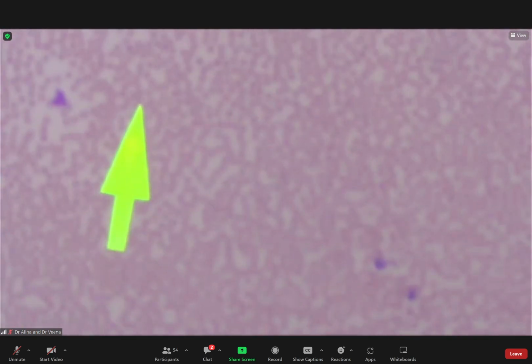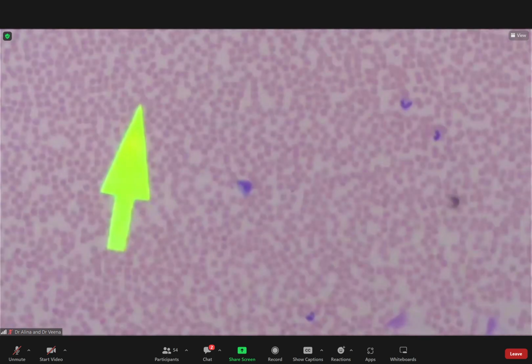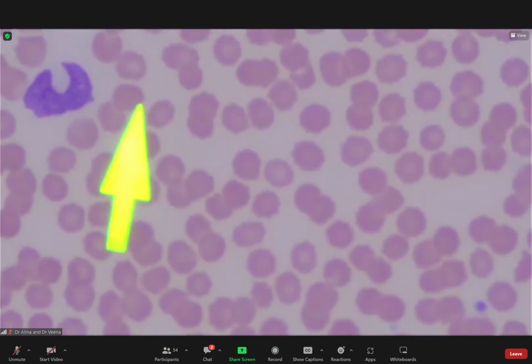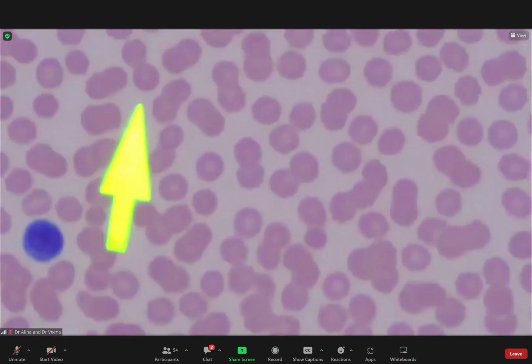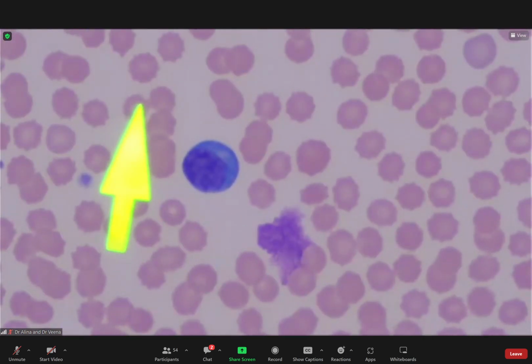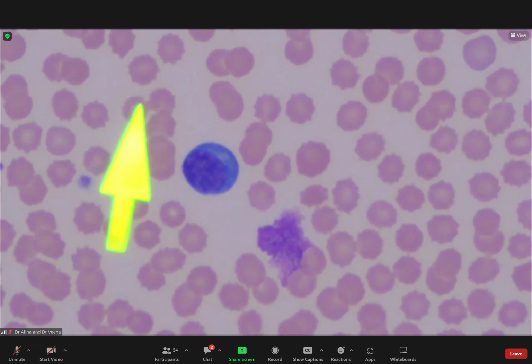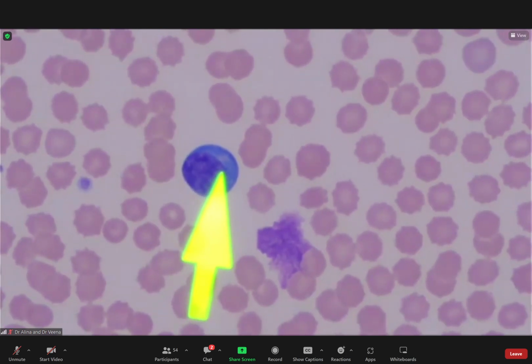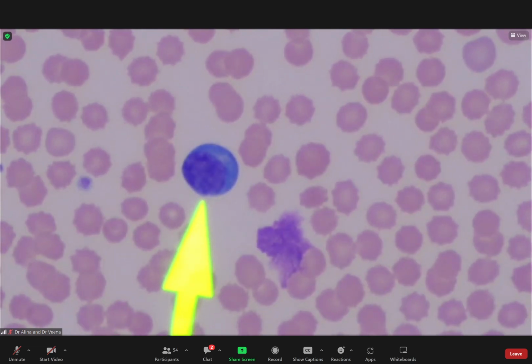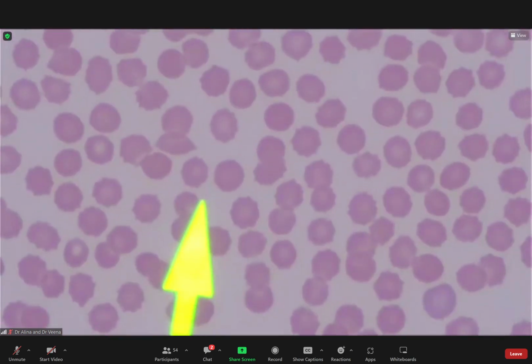So again, the white cell is slightly high. And you see a lot of these cells. They have eccentric nucleus. They have a very bluish cytoplasm, a very subtle Golgi clearing here. Okay. And their nuclear features are very, very mature. Okay, what are these cells? Plasma cells. Okay.